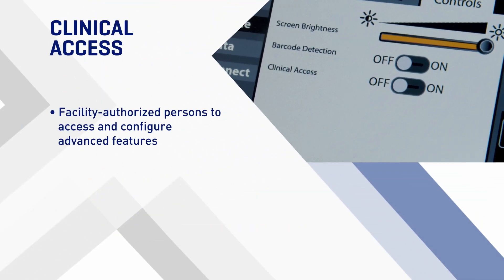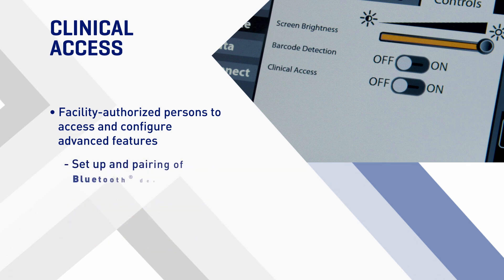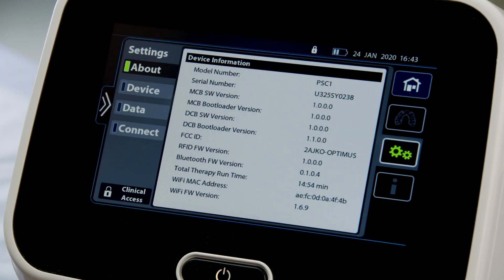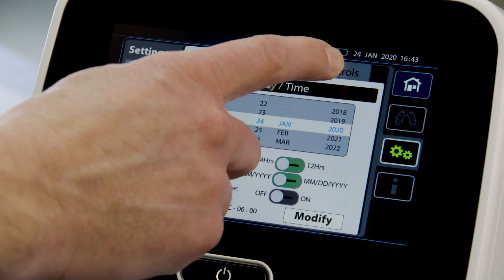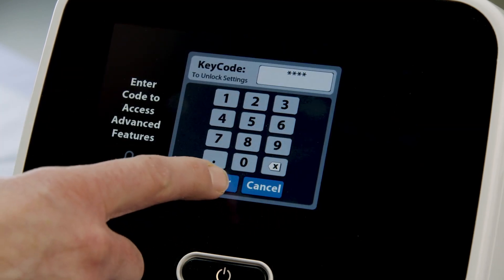Clinical access allows facility-authorized persons to access and configure advanced features. These include adjustment of the maximum pressure ceiling setting available to the user, modification of the preset therapy settings, import of device settings, setup and pairing of Bluetooth devices such as a barcode reader or pulse oximeter, upgrade of the system firmware, and import of the Health Level 7 (HL7) standard file. To access, press Device and press Controls, then slide the setting for clinical access to ON, enter the key code, and press Enter.